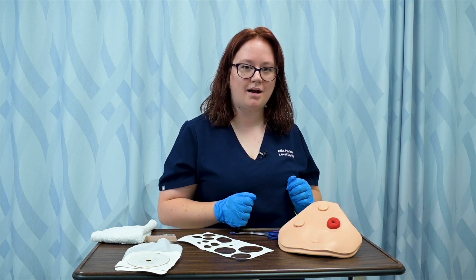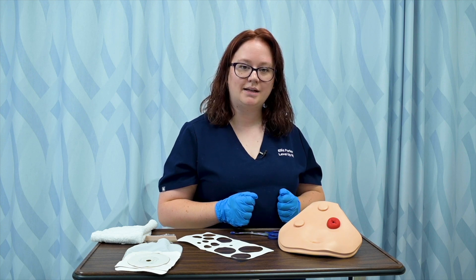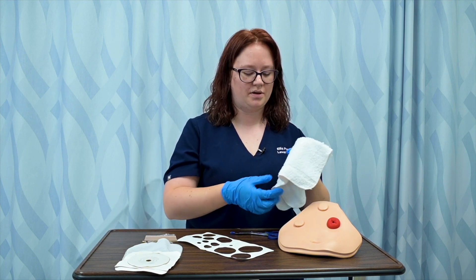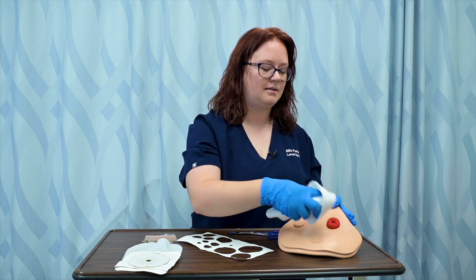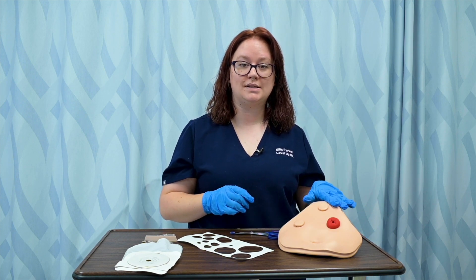I can now assess my ostomy, making sure that it's beefy red and that it doesn't have any signs of ischemia or skin breakdown in the periostomy area. I'm going to get a damp, warm washcloth with no soap and just clean around the external part of the ostomy, then making sure that it dries completely before I place the new system on.